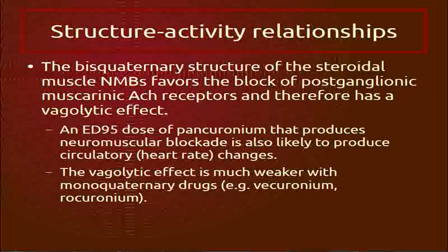Is that phase 1, phase 2? That's right. Phase 1 blockade, succinylcholine. Phase 2 blockade, succinylcholine. So phase 1 block is, here's my first round. No succinylcholine, it looks like this: 1, 2, 3, 4. With succinylcholine, if I get a response, they're all equal. Fade now is 1, 2, 3, 4. It's phase 2 for suc. So it's normal.